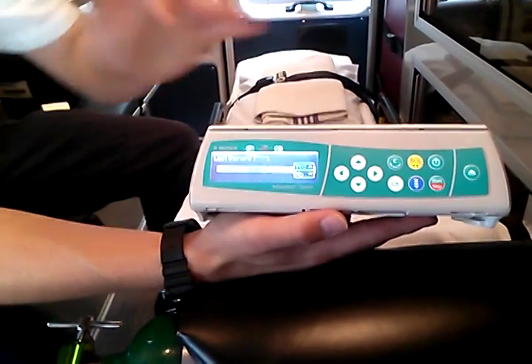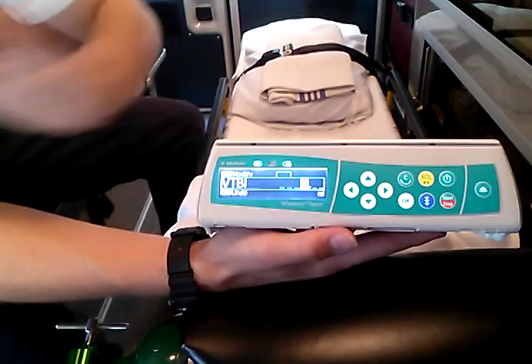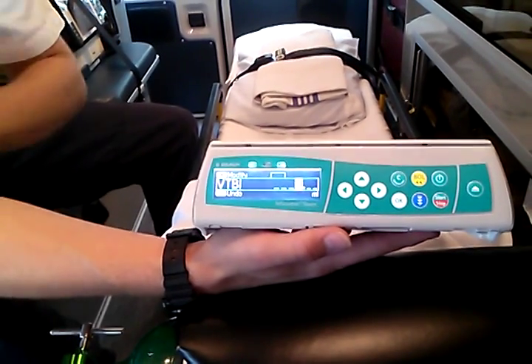It'll ask if you want to use the last therapy — we're going to hit no. Some pumps will also ask if you want to use the drug library. That is not necessary to do.